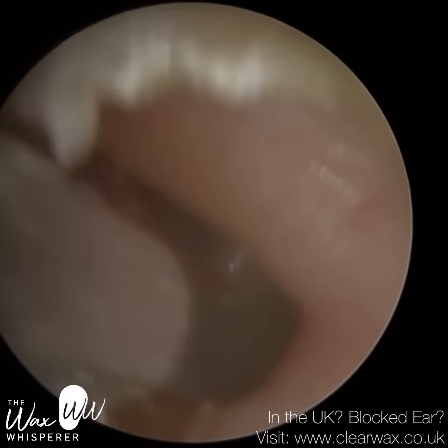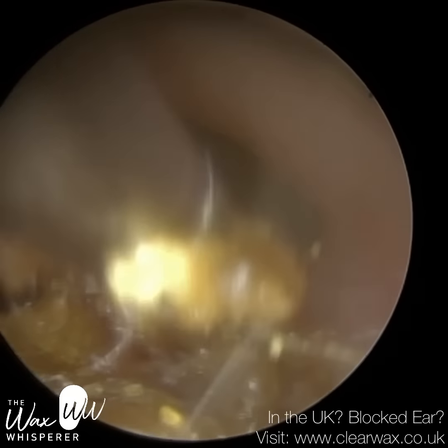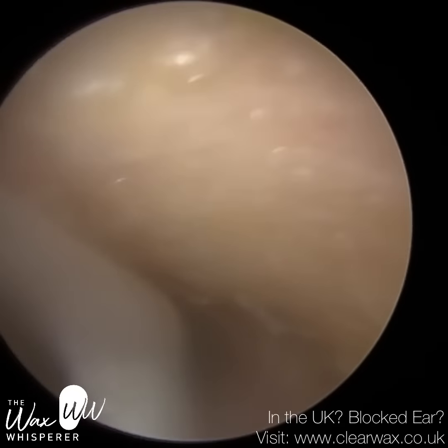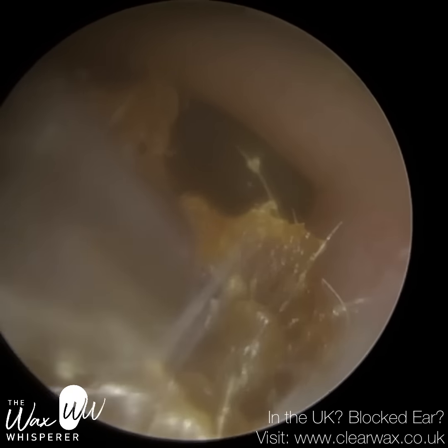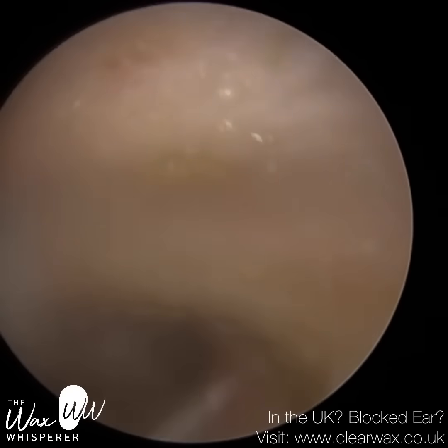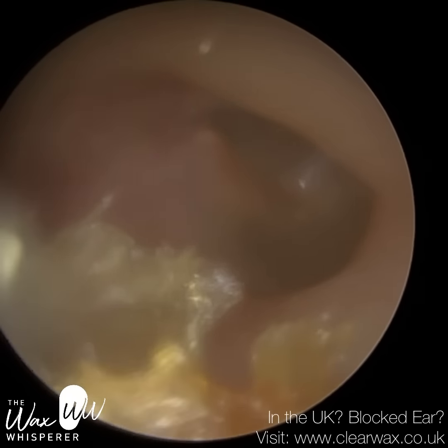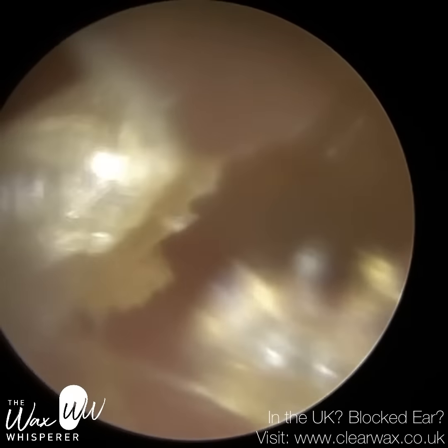Sometimes when you remove dead skin in particular, you get what we call clarinetting. So the skin violently flaps as you're suctioning it at the tip of the suction probe, and that emits a very loud, high-frequency squeal. It's not only loud for the patient, it's also loud for myself. So quite often, if I'm removing dead skin like I am here, I just attach a fine end suction probe, like an extension.